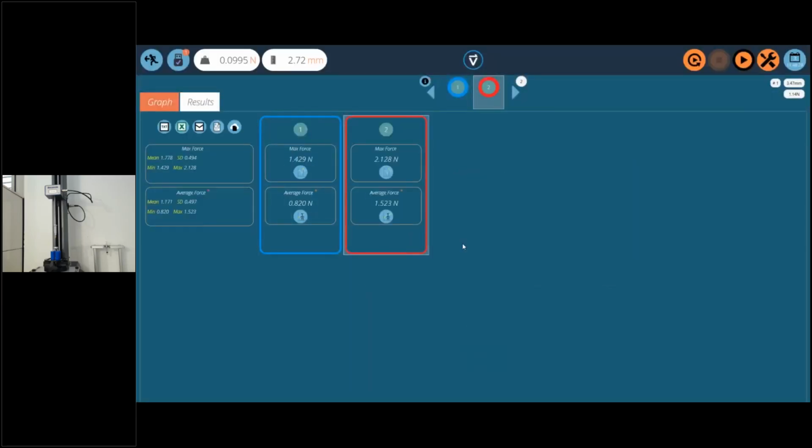So that was the second test. This is a test you would do on the cap. Now, if you wanted to use this on simulated skin, this is where it gets to be a little bit more fun. So first thing I'm going to do is just raise our needle up just a tad so I don't poke myself. I'm going to remove that. And this is something you can get on Amazon that I did mention. It's a simulated skin that you can use if you don't want to call on some of your employees to be volunteers for this test. This works just as well. So we'll just put that on and open that, and it just grabs that once you open it to keep it static. So, there we go, nice and solid.